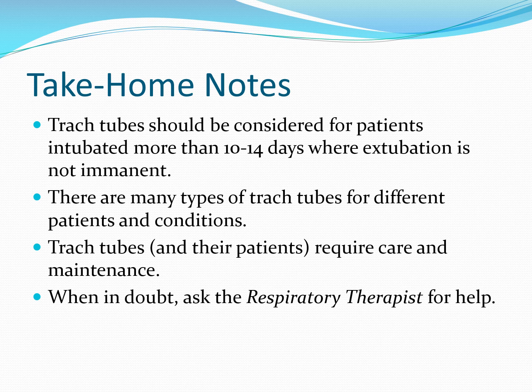The normal humidification and filtration that happens, that's done by the nose, is not done as well. So there's considerations there. You don't get something for nothing. The patient gets the ability to breathe. If they're weaning, they can maybe wean better, but devil's in the details, and it needs to be done right. And when in doubt, ask a respiratory therapist for help.